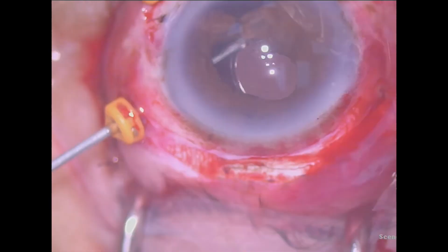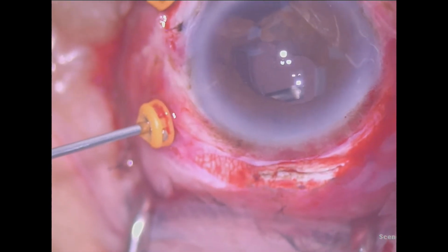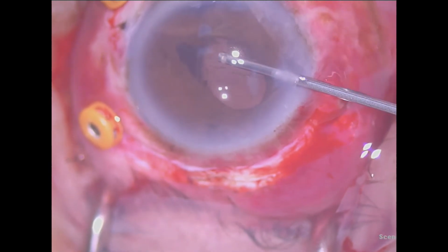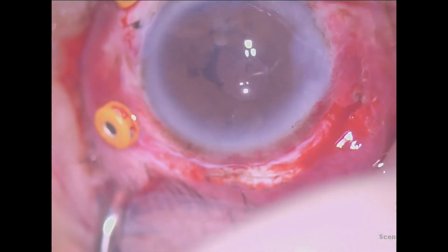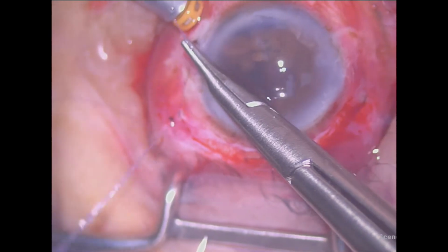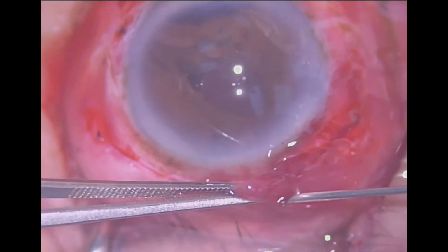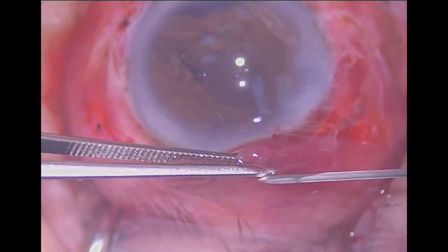Viscoelastic is removed and additional miostat is injected into the anterior chamber. Sclerotomy wound is closed with micro suture. The scleral tunnel wound does not require suture. Lastly, we give subconjunctival steroid and antibiotic.